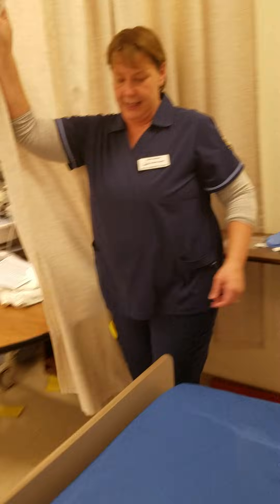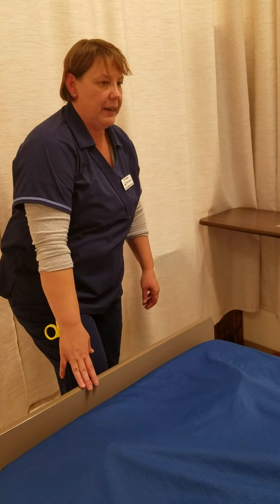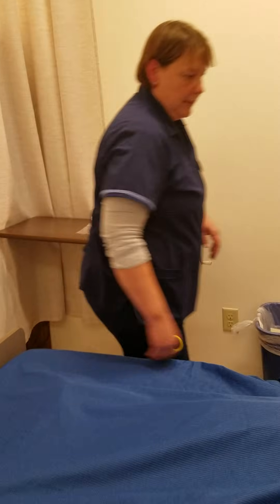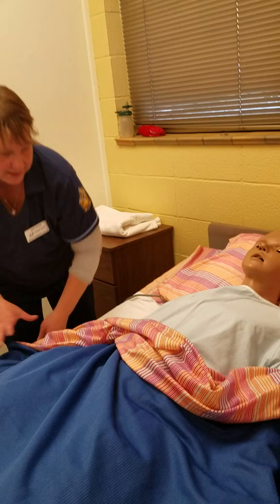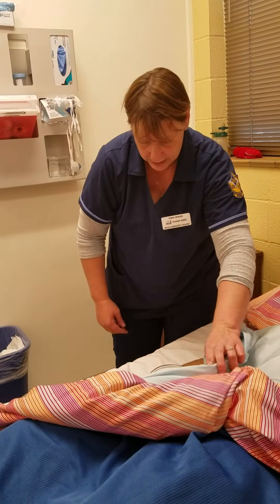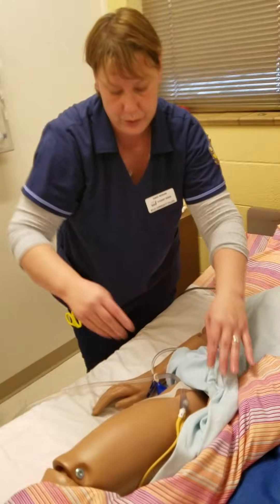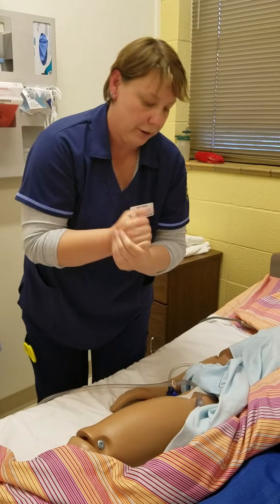I'm going to have his family exit the room just for a few moments while I get this sample, and I'm going to go ahead and cover for some privacy. I'm going to raise the bed up to a nice working level for me. Jose, this just takes a few minutes — it's not very long and it shouldn't be painful or uncomfortable for you at all. I'm just going to expose the area and the port that I'm going to draw the urine from.